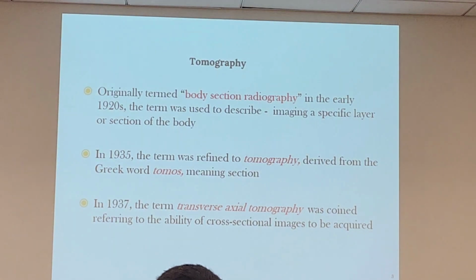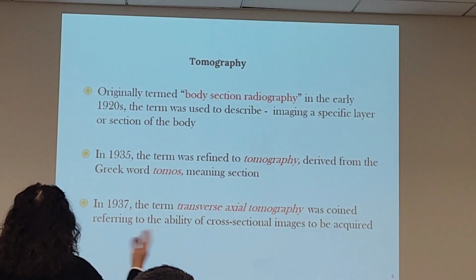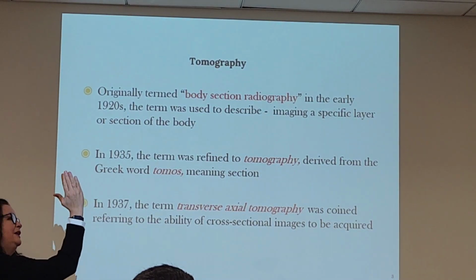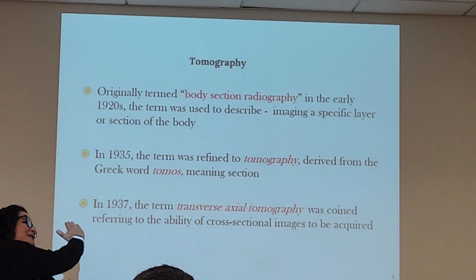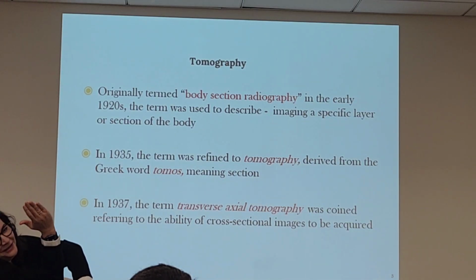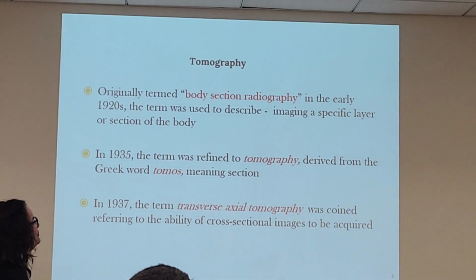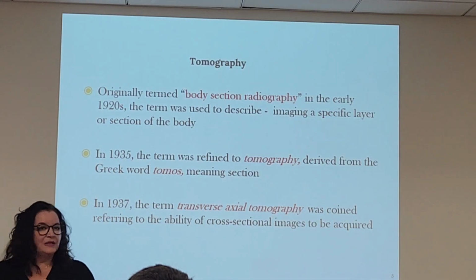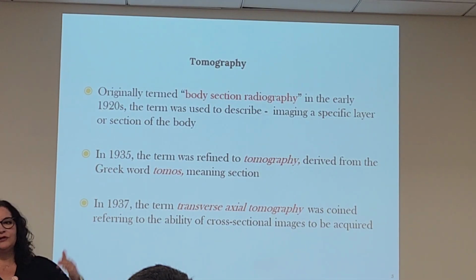And so we did a lot of tomography, you know, IVPs, intravenous pyelograms. There was a machine that you aligned, and it turned one way to stay perpendicular to the image receptor, and then you went another way to stay perpendicular to the image receptor. This is where the notion came from for CT. Just as we did in plain X-ray, we started to generate that same type of technology.